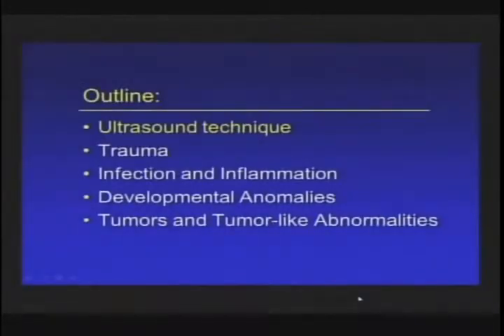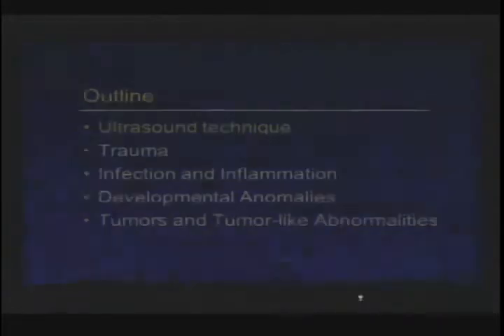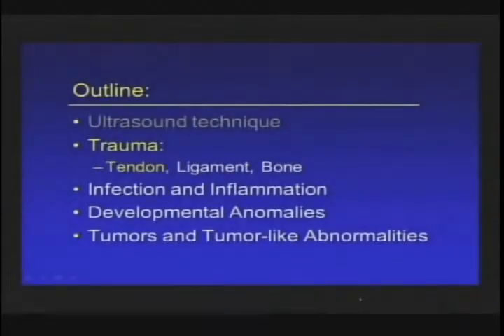So the ultrasound technique was just demonstrated. So we're going to go right on to talk about pathology. So first I'm going to talk about trauma to a tendon.